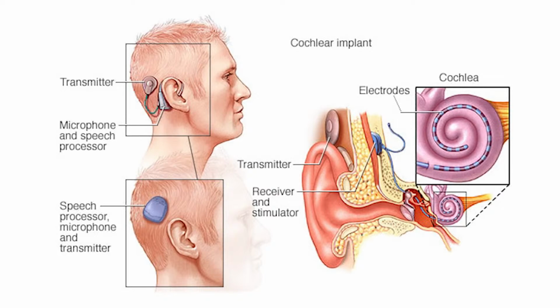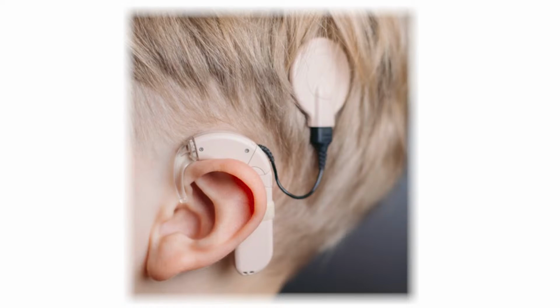It is drilled to the bone. So that is the implant which remains under the skin permanently. There is another component called the processor. The processor is fitted over the skin after the skin heals after surgery, and then the processor is able to communicate with the implant, and the child is able to hear, or the deaf person is able to hear.